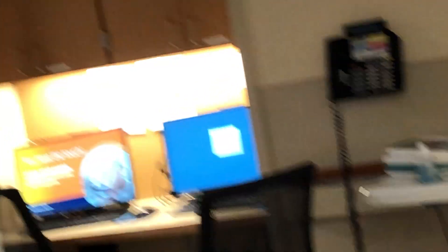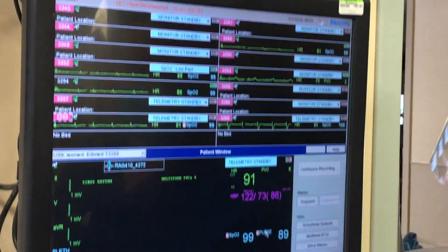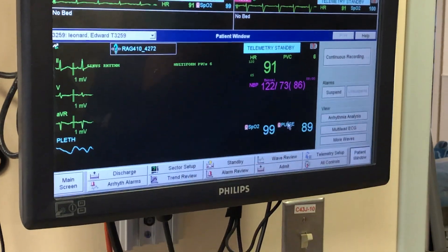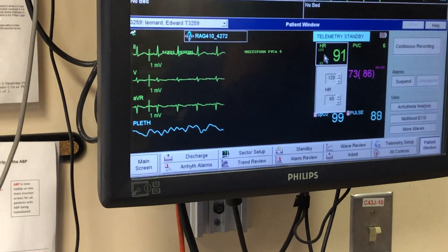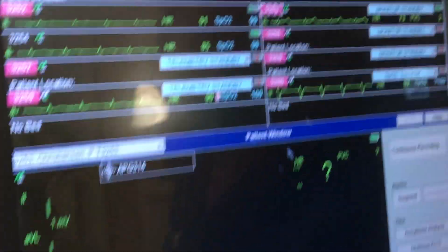Now let's show how to verify your arrhythmia alarms — what the alarms are set up for, the highs and lows. This is something we go over each shift. You can change the settings; we don't usually change them.